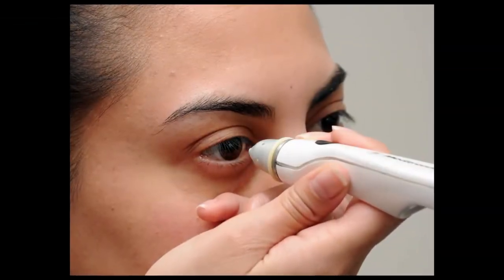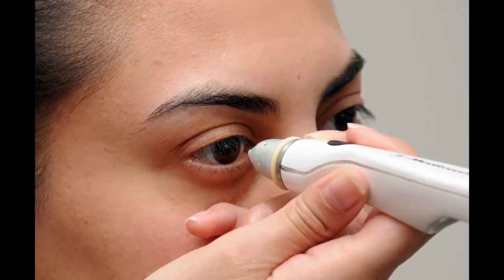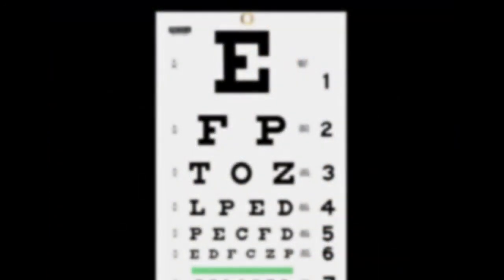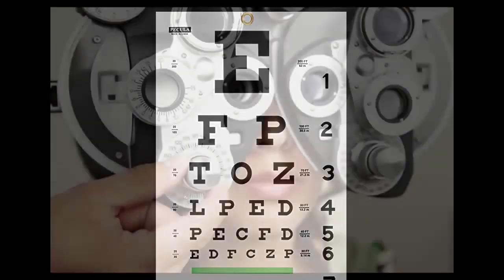After the procedure, we will check your eye pressure about a half hour later, and then you are free to go home. Since you are not sedated for this, you can drive yourself to the appointment as long as you realize that one eye will be dilated and be light sensitive. Wearing sunglasses can help with this, especially when driving. There are usually no drops to use after surgery, and you'll notice improved vision after your dilation wears off in about a day. If the other eye needs treatment, this can be scheduled for a future date. In other words, we don't perform laser surgery on both eyes at the same time.